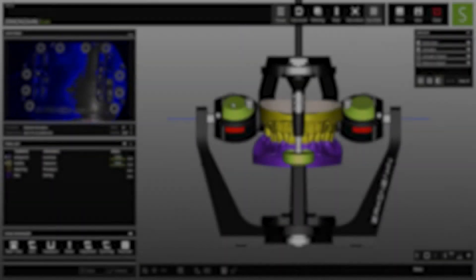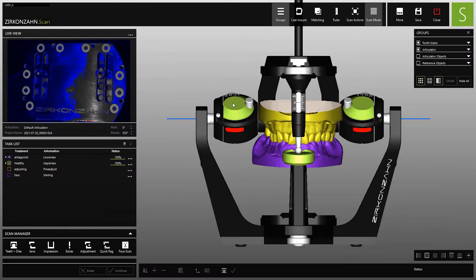In addition to the various scanning options, the Zirconzon scan software offers many other functions, including the placement of models in the virtual articulator.